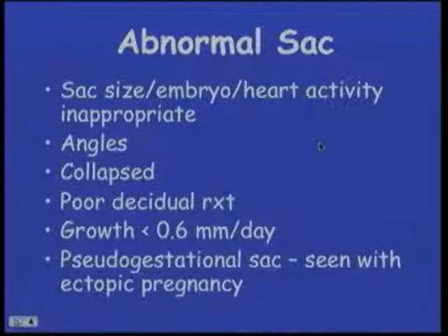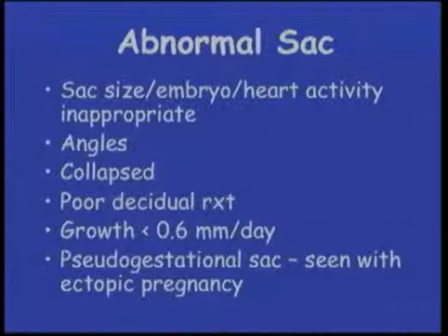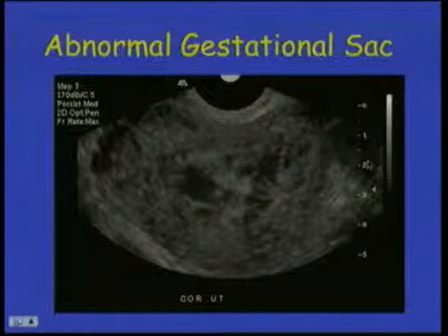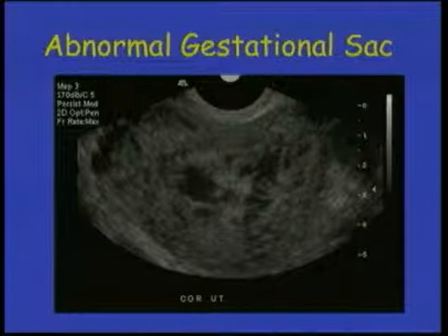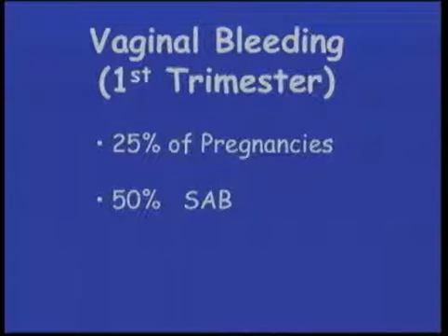Here we can see a very small crown rump length with a tiny yolk sac. An abnormal sac will have sac size, embryo, and cardiac activity inappropriate for gestational age. The sac may be angulated or collapsed, with a poor decidual reaction, and on follow-up studies it will grow less than 0.6 millimeters per day. A pseudo-gestational sac seen with ectopic pregnancies can also mimic a gestational sac. This abnormal gestational sac shows a large yolk sac with irregular, angulated edges. Another image shows multiple lucencies within the sac, which is worrisome for trophoblastic disease. Approximately 25% of pregnancies will have vaginal bleeding, and approximately 50% of those will go on to spontaneously abort.